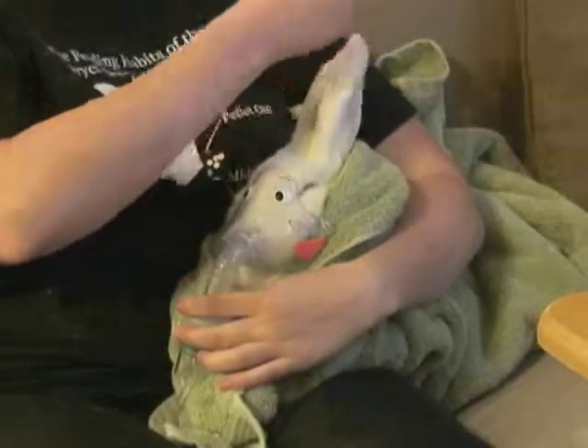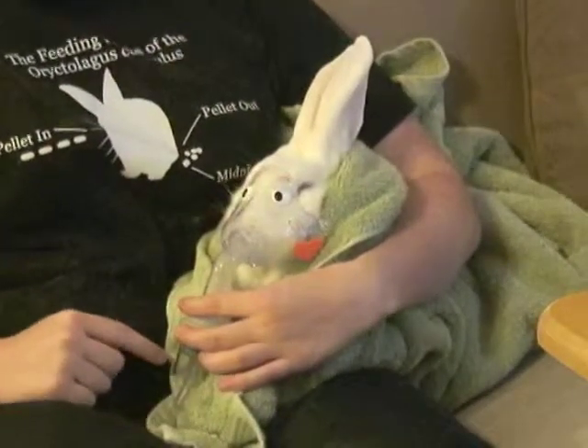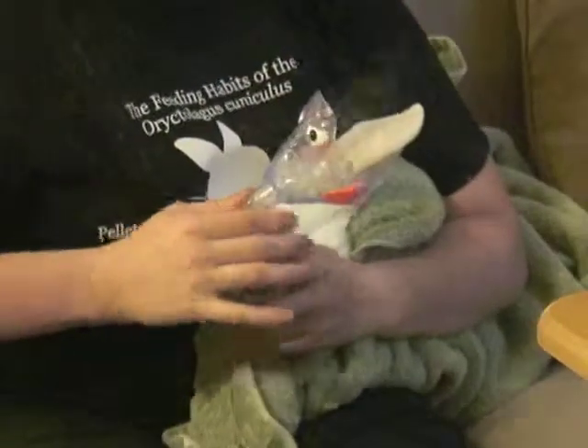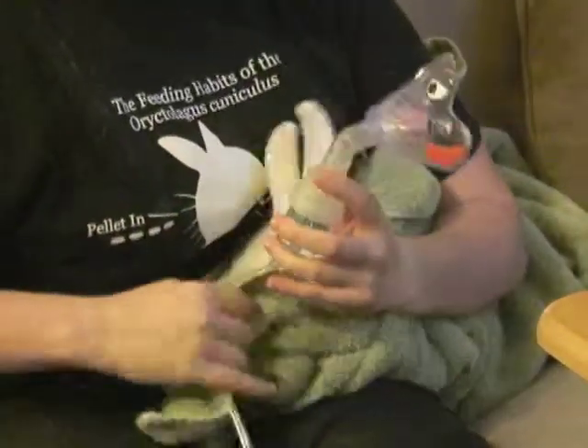It's been about 15 minutes now. She's at the end of her patience and we're at the end of our medicine cup. Pasteurella is one of those things that we've already tried treating twice with antibiotics, and it wasn't until we got the nebulizer that we were actually getting somewhere. So I think that's been the biggest difference — definitely.